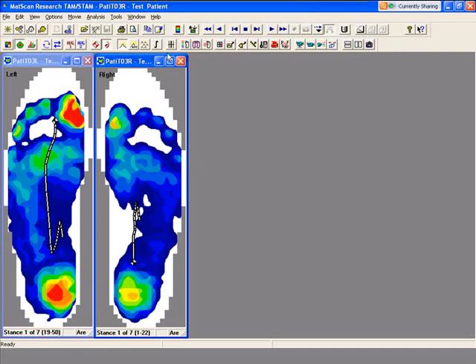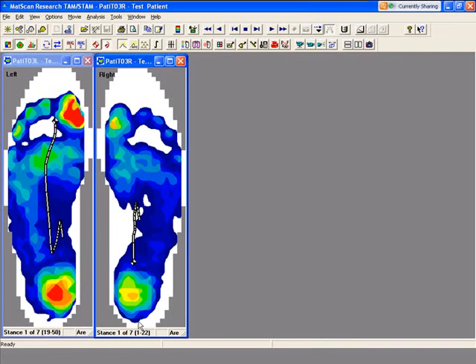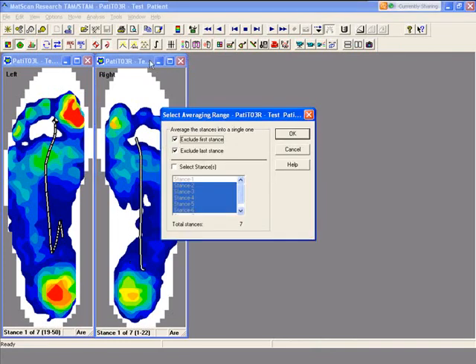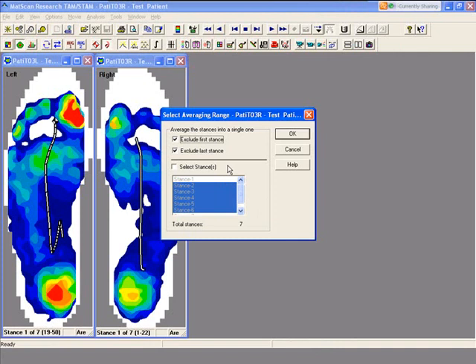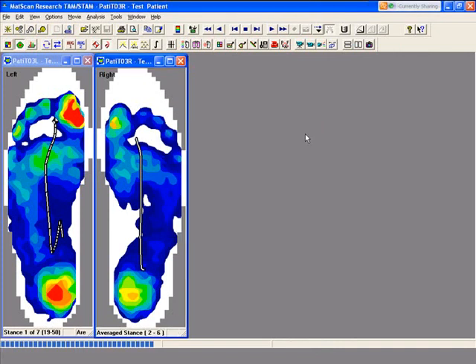Now we'll look at peak stance averaging. What that does is it averages each one of these stances, or you can select what stances you want to average to create an average image. The default is to exclude the first stance and the last stance because usually those aren't very good recordings.